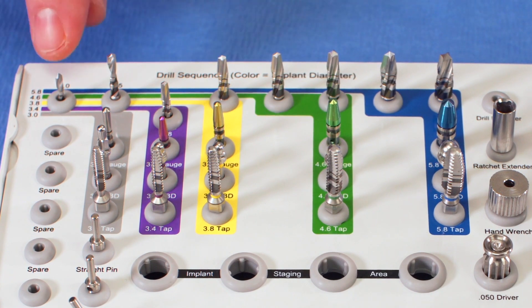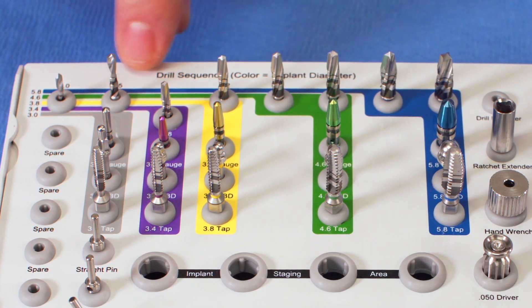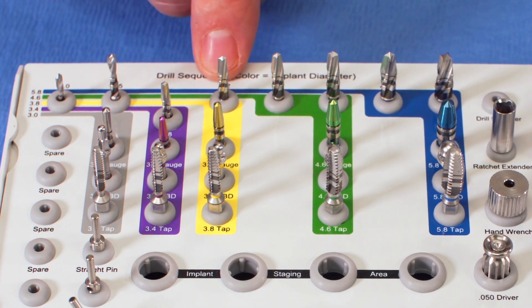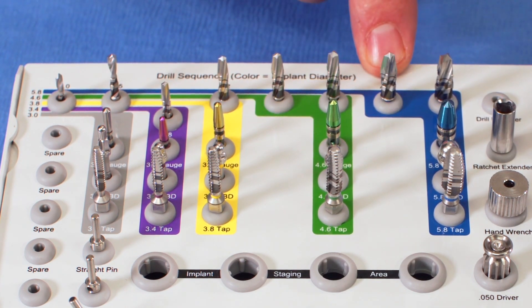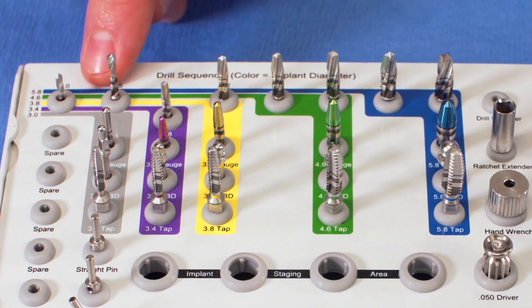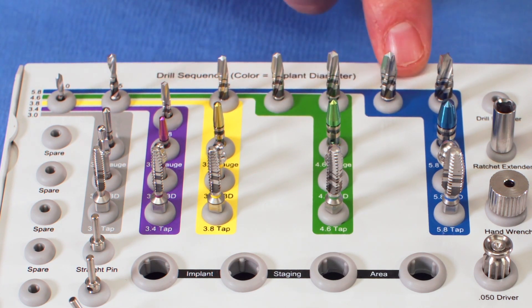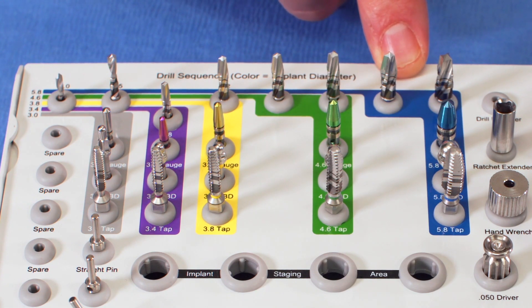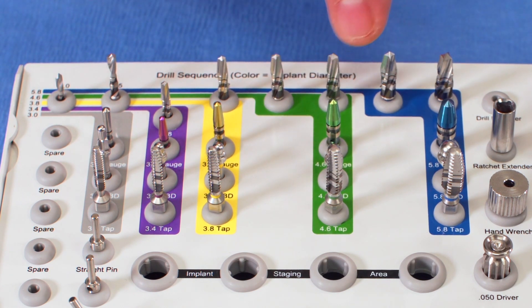In this kit there is a 2.0 starter drill, a 2.5 starter drill, and then the drilling sequence moves into larger drills: 2.8, 3.2, 3.7 millimeter, 4.1 millimeter, 4.7 millimeter, and 5.4 millimeter. The first two drills are for creating and enlarging your osteotomy, and the larger drills expand the osteotomy to different sizes for implant placement and depth. Color coatings indicate stopping points at various drill lengths and widths for different implant sizes.